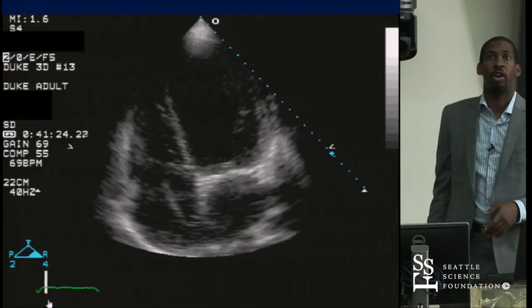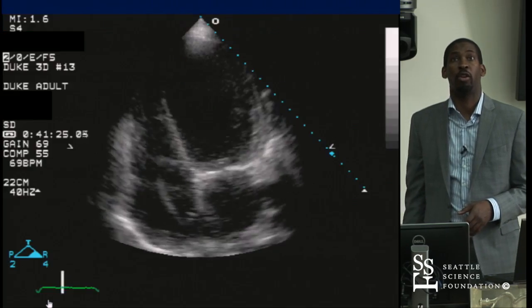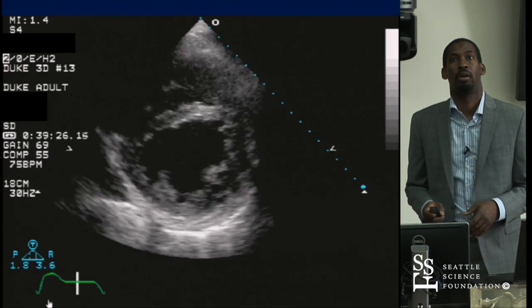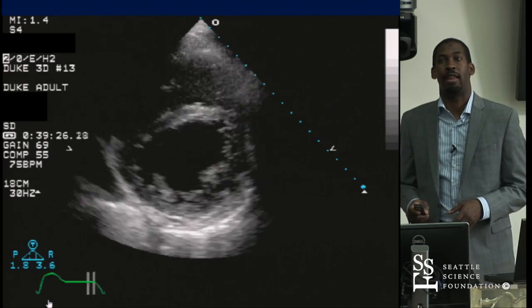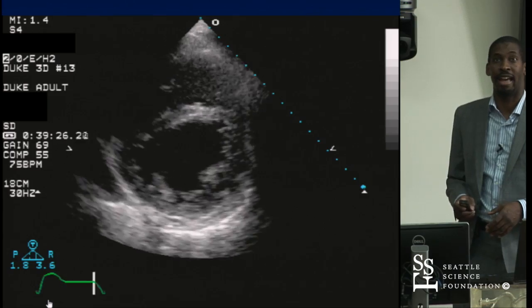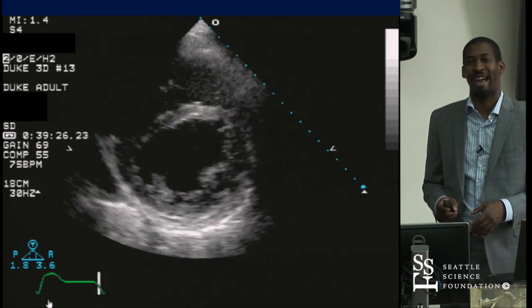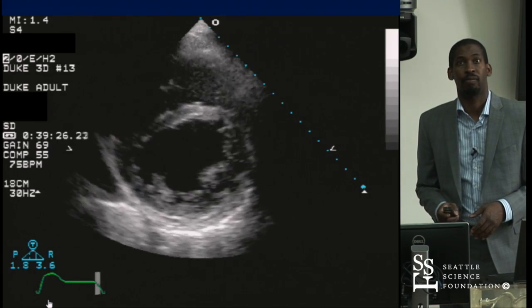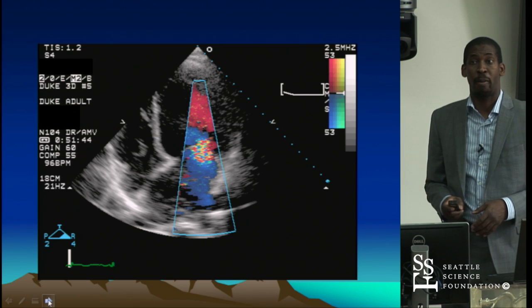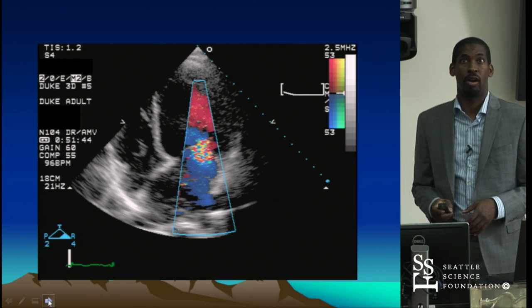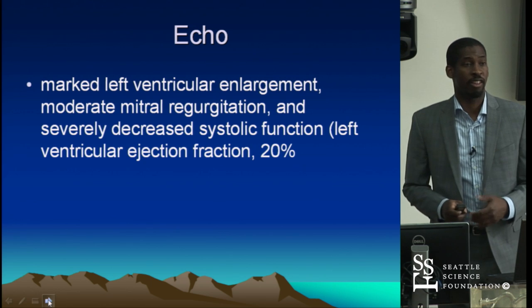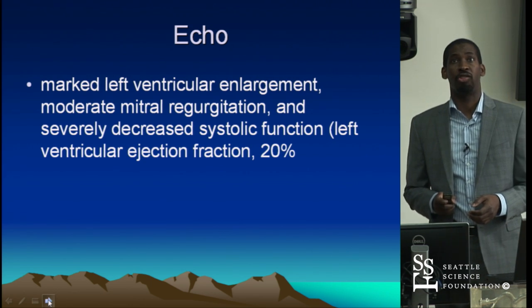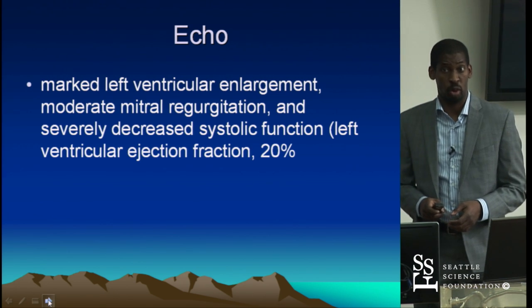On echocardiography, you can see she has a big, sick left ventricle. In the short axis view, you can really see that dyssynchrony — the heart segments are not all contracting in unison owing to that left bundle branch block. She has a fair amount of mitral regurgitation on color Doppler. So she has marked LV enlargement, moderate MR, and severe LV dysfunction with an EF of 20%.